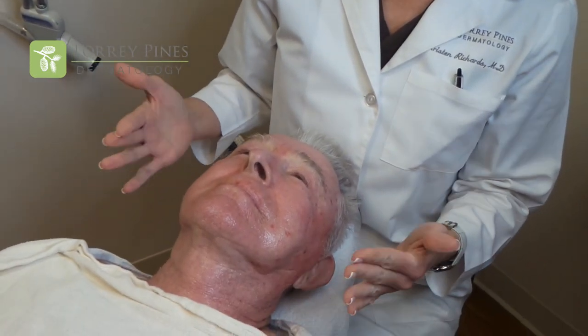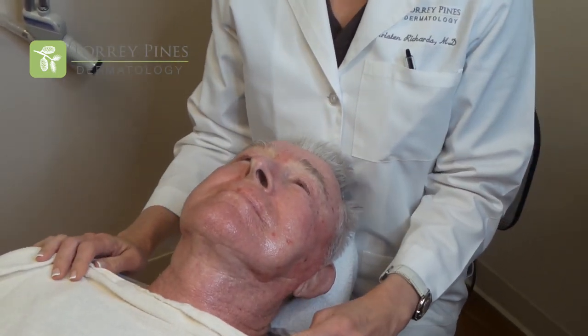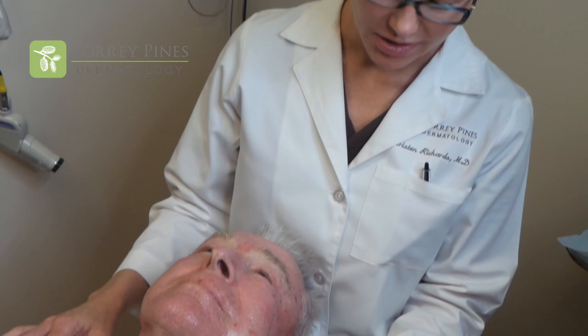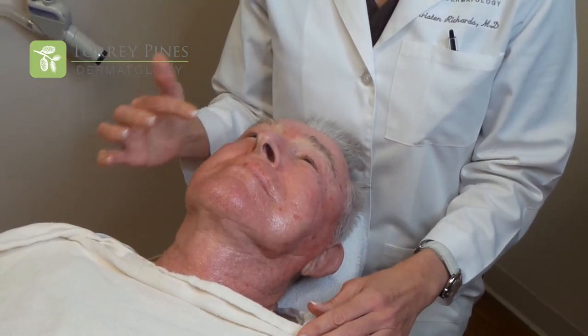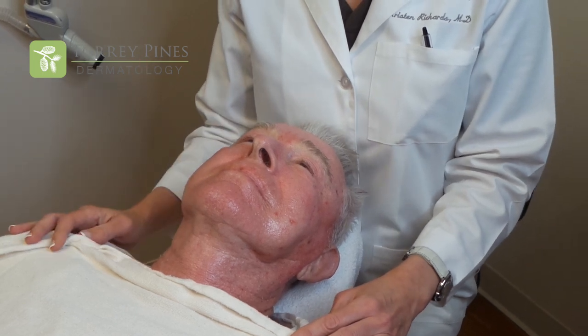We've now completed our Active FX on our patient with the sun damage. He's a little bit pink and feels a little bit warm. The warmth and pinkness lasts for about 60 to 90 minutes and then it suddenly goes away. The patient will start to peel around day four or five and have brand new fresh skin at day seven. This is a very quick recovery for the amount of improvement he's going to see. The Active FX laser is used to remove sun damage, tighten and get rid of fine lines and wrinkles, and for scar remodeling after Mohs surgery.